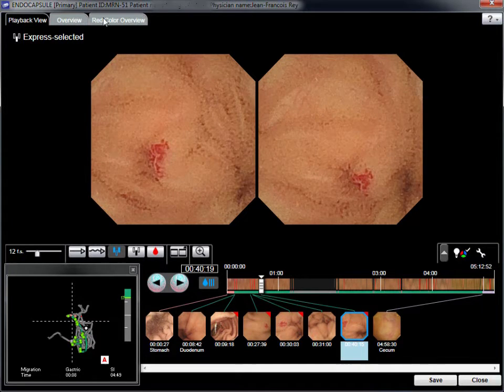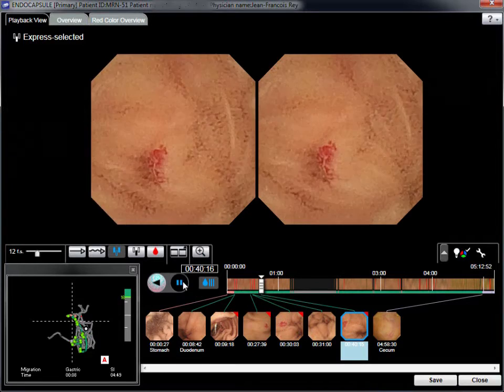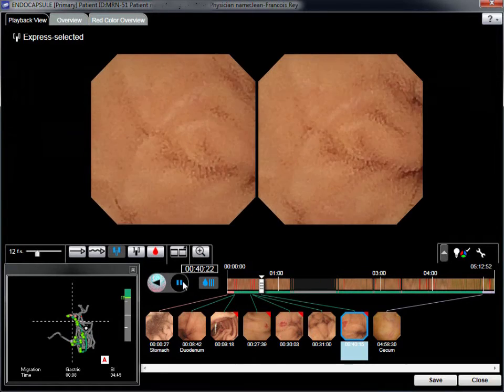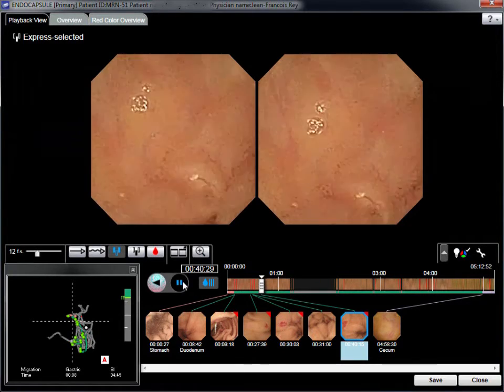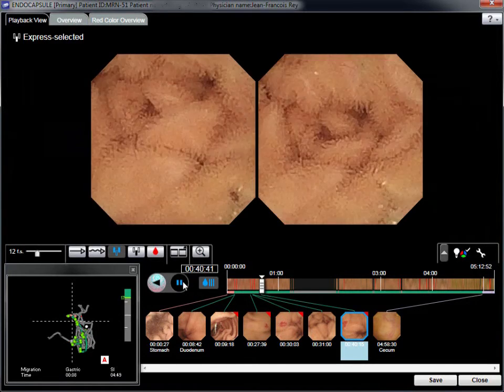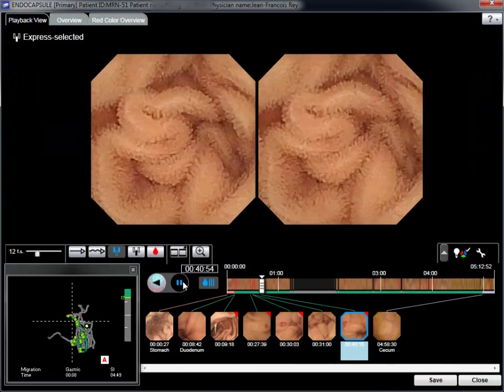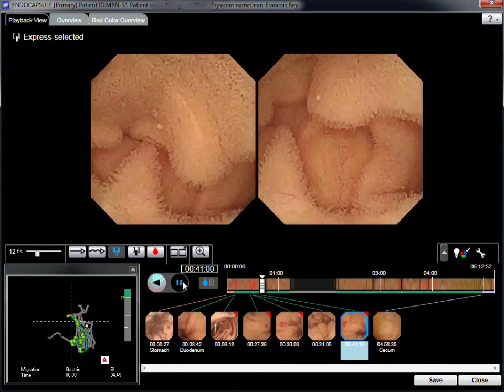In this case, diagnosis is achieved using only the express-selected mode. The skip mode, or even normal mode, are not needed, as the diagnosis is clear.